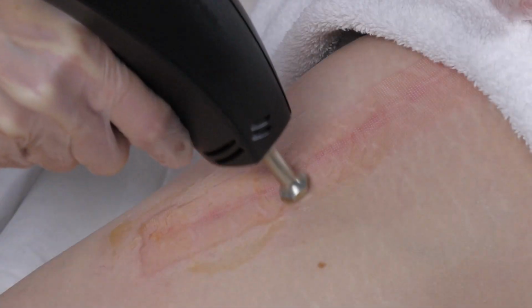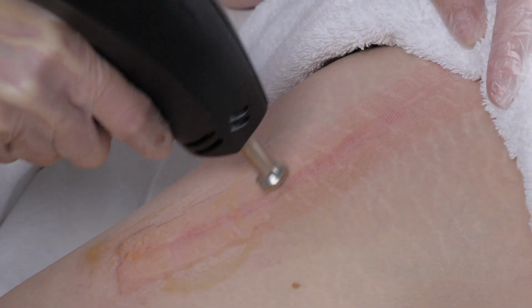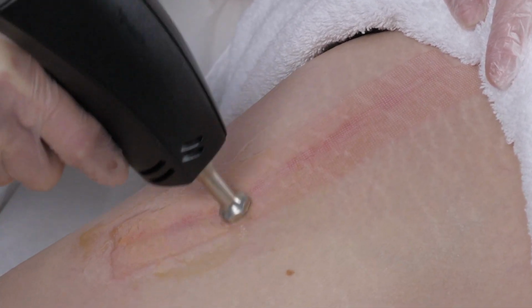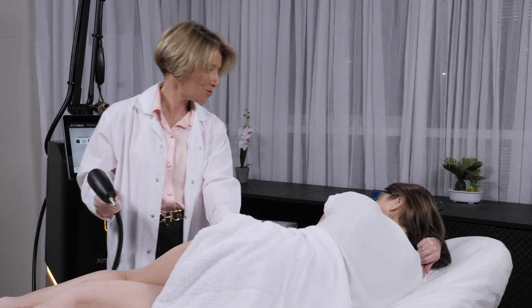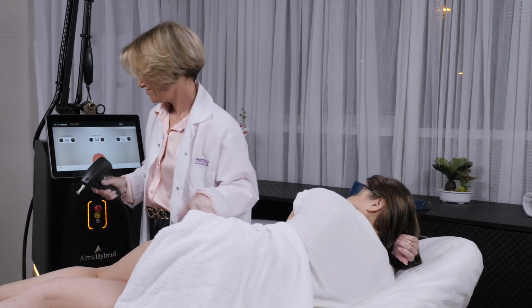Press the foot switch once. Move the applicator over the treatment area in a slow circular motion until all is absorbed. You have completed your treatment for scar revision 1 to 2 millimeters.